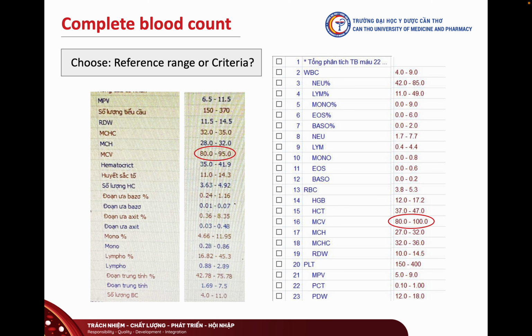We will use the standard diagnostic criteria, which are evidence-based cutoffs that are consistent no matter where the test is performed. And I want you to practice using these criteria, not the automated reference intervals printed on the report. That is very important, and I would like you to remember.